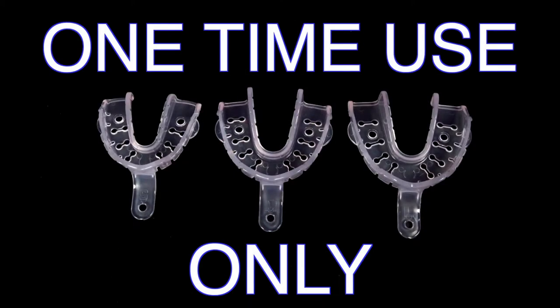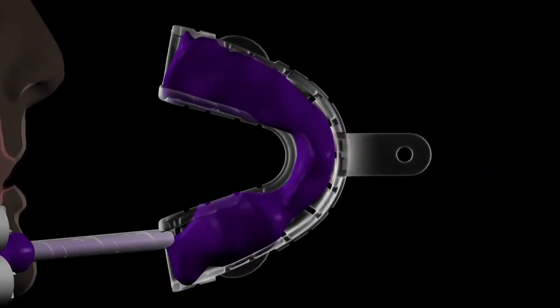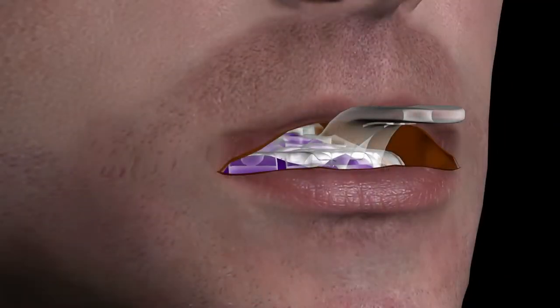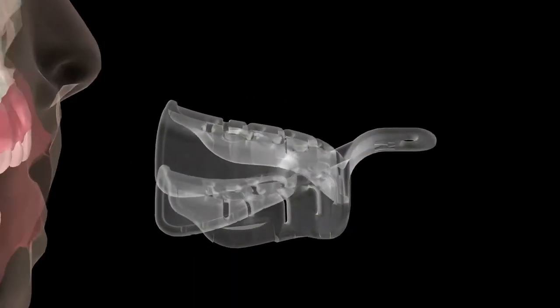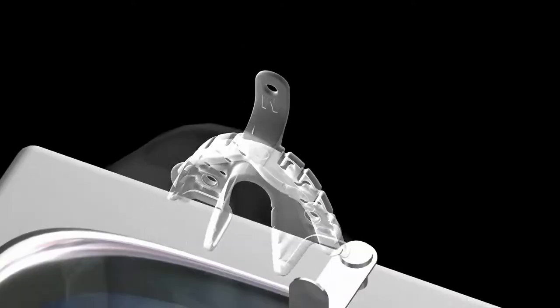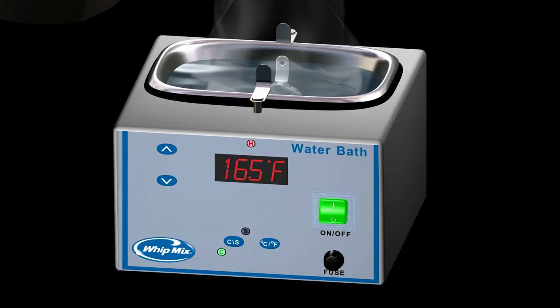These trays are for one-time use only. They are designed optimally for use with impression materials with viscoelastic properties such as polyvinyl siloxane (PVS) or polyether materials. The purpose of the low-temperature tray is to be able to customize the proper fit in a patient's mouth without being uncomfortable to the heated tray. This is accomplished by utilizing a controlled-temperature hot water bath apparatus set at 165 degrees Fahrenheit or 74 degrees Celsius.